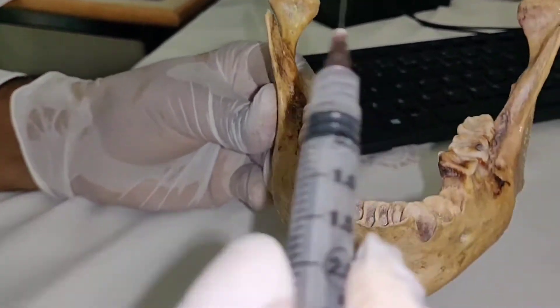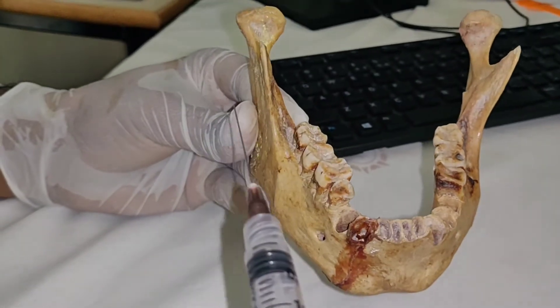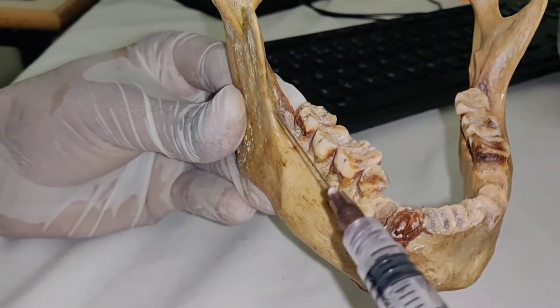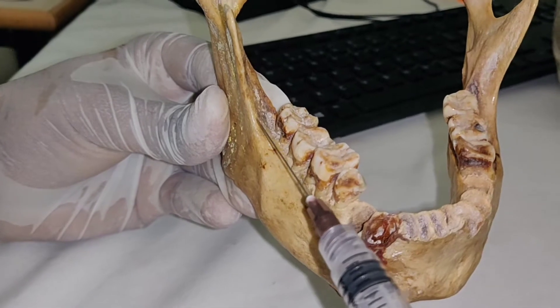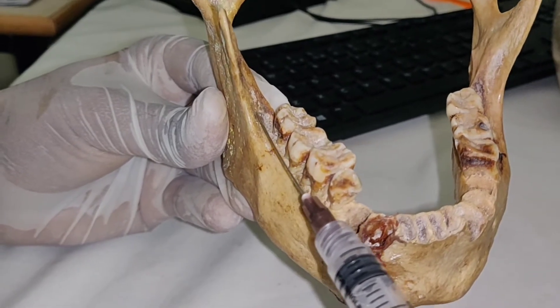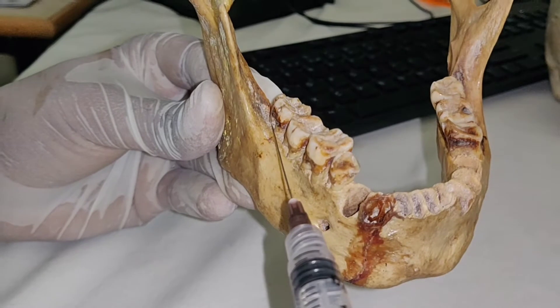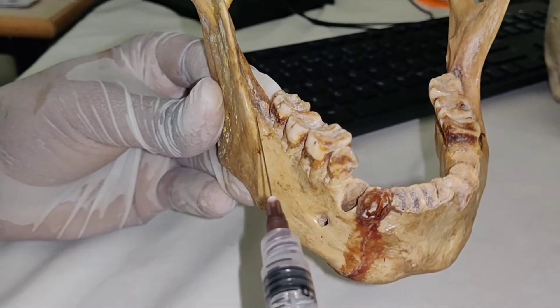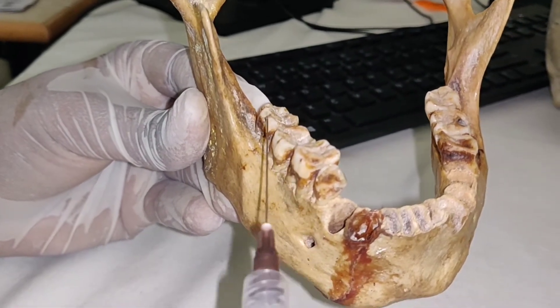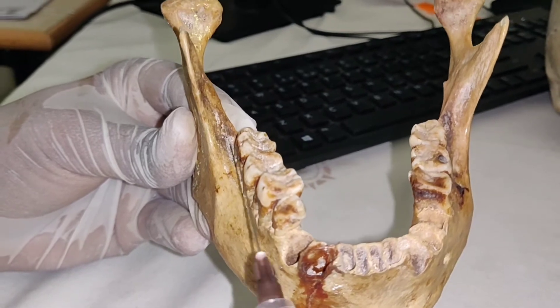Apart from giving the inferior alveolar nerve block, it is also necessary to give a buccal nerve block to anesthetize the buccal vestibule of the first, second, and third molars. This is an essential step whenever you perform an inferior alveolar nerve block.